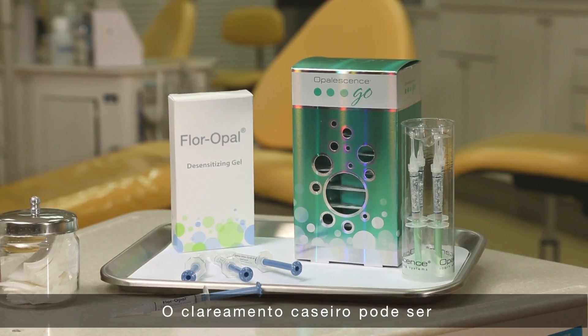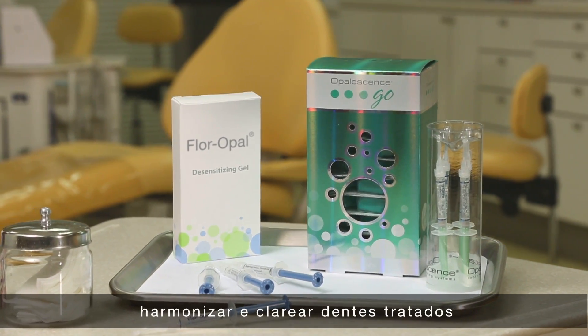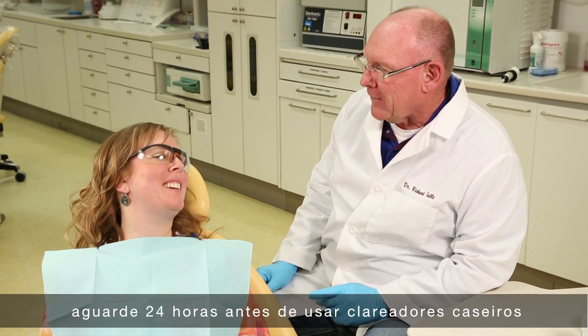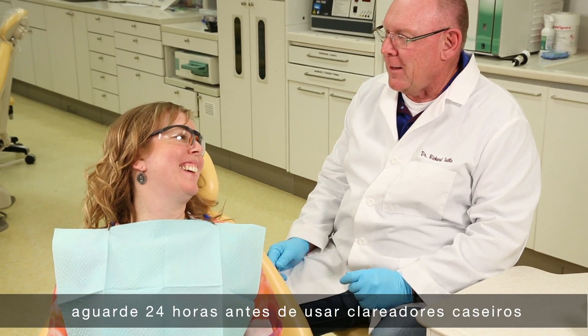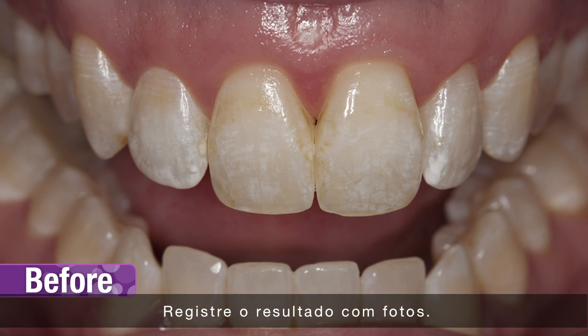Take-home whitening products can be used pre- or post-op to blend and further whiten treated teeth. If the patient is experiencing any sensitivity, wait 24 hours before using take-home whitening products. Take post-op photographs to record the outcome.